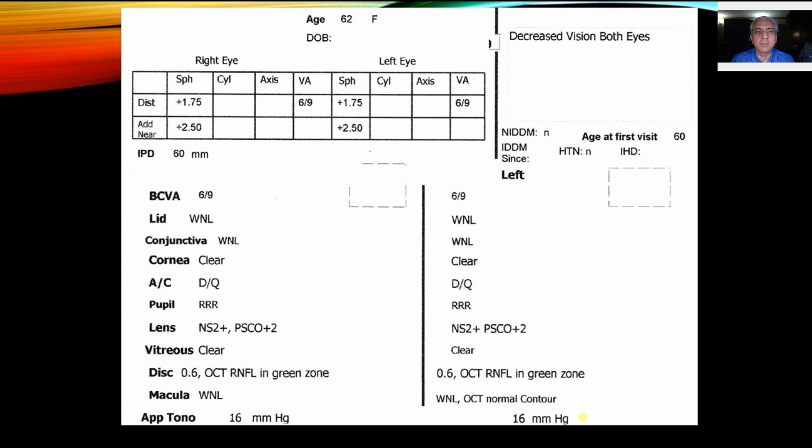She's non-diabetic, non-hypertensive, and has no ischemic heart disease. This is the slit lamp examination; we'll be focusing on the cup-to-disc ratio. We immediately change over to a superfield lens and start looking at the disc. If the pupil is not very dilated, it can be difficult to capture the disc, but this shows how you should maneuver toward the disc. Once you've identified the disc, you can keep it at low magnification.